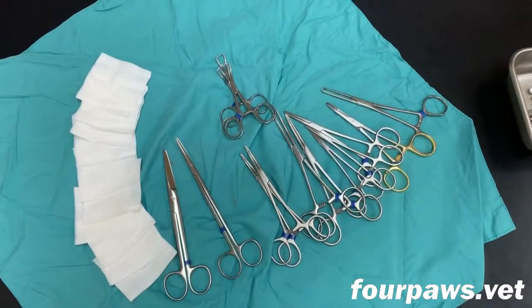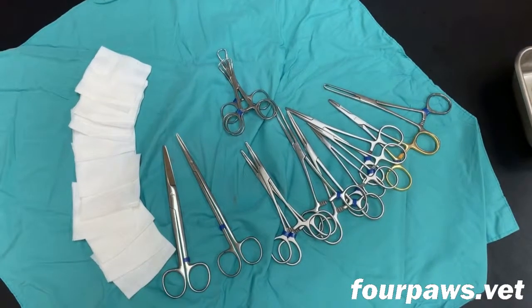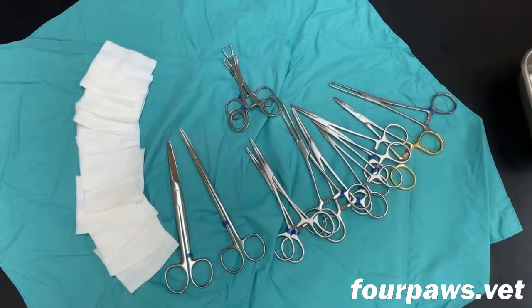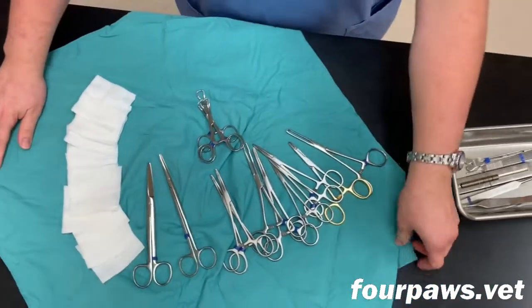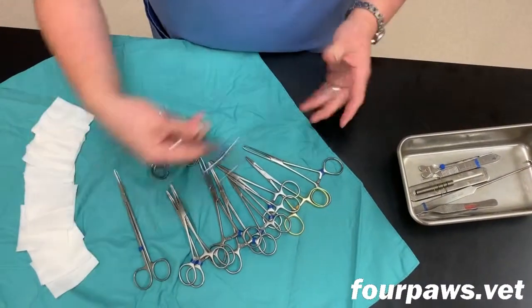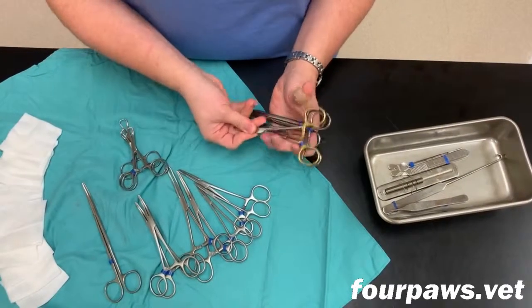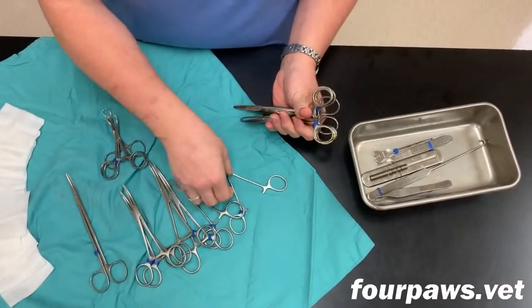Depending on the type of surgical pack that we're preparing, there are a different set of instruments that should be included in each pack. For example, a spay pack is going to have a different set of instruments than a neuter pack. If you look closely, you can also see that there is a small colored band on each surgical instrument in order to help us make sure that the correct instrument goes into the correct color-coded pack.